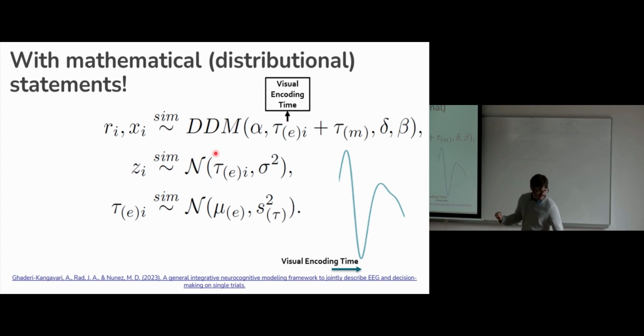And this is really falling out from the fact that I'm now treating the EEG as a dependent variable, and also modeling the noise. And I think this is really a key aspect of EEG that we don't usually think about, because we're often treating it as an independent variable in regression analysis, or we're treating it as a dependent variable and then having something that should also have noise as an independent variable. But now I'm treating both as dependent variables, both the behavior and the EEG.